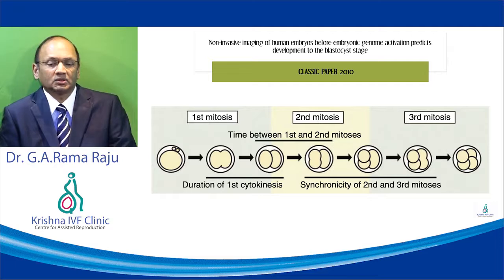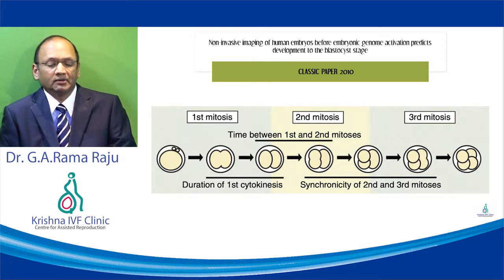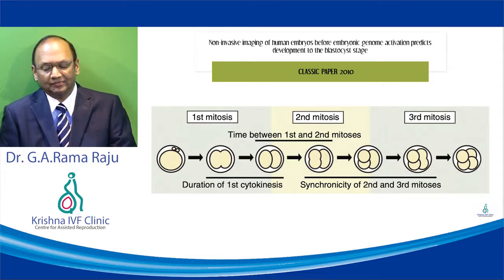He looked at 3 parameters: the duration of the first cytokinesis, the time interval between the first and second mitosis, and the synchronicity of the second and third mitosis, and then correlated these with development to the blastocyst stage. This is the classic paper which everybody interested in time-lapse technology should read.